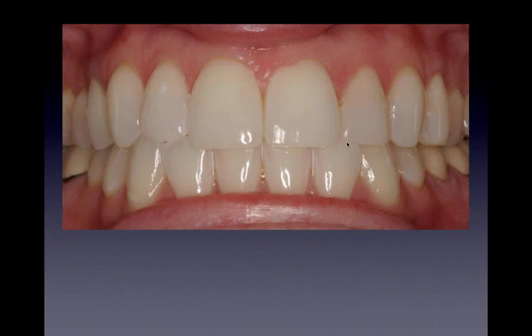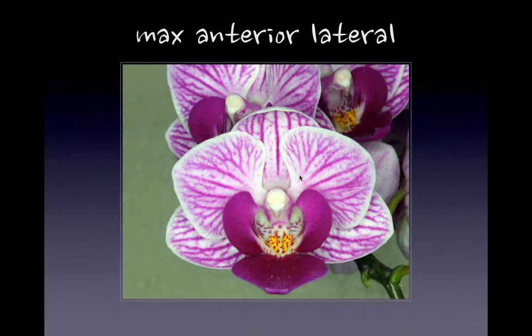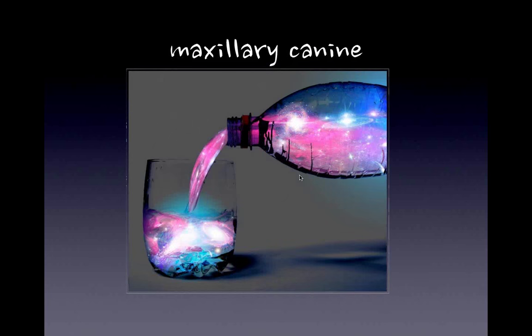You can see here I've adjusted the lower so it's not really hitting it. The canine is hitting the canine. I'm trying to get it away from this bonded area so she doesn't break it. Maxillary anterior lateral. This is the maxillary anterior canine.